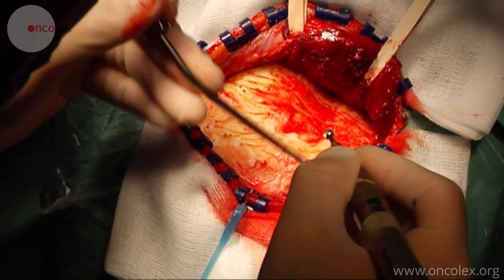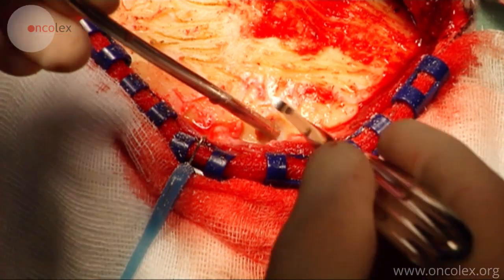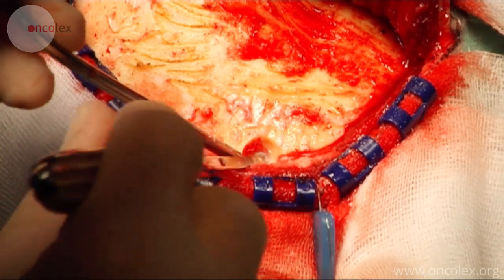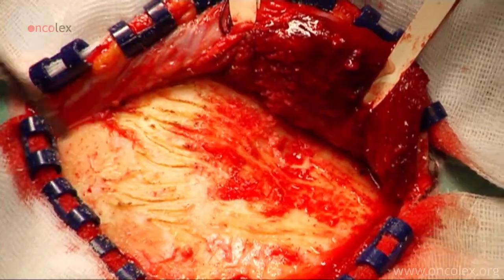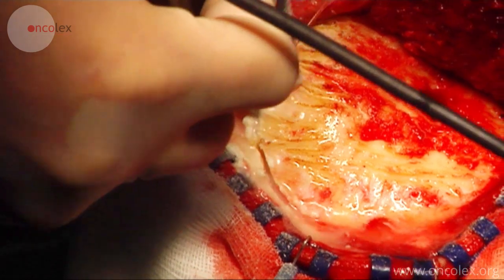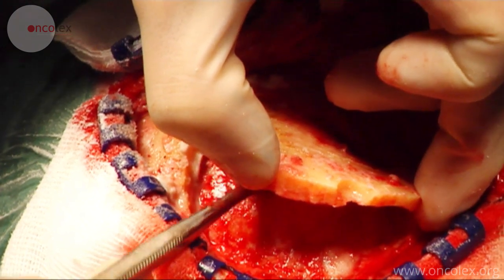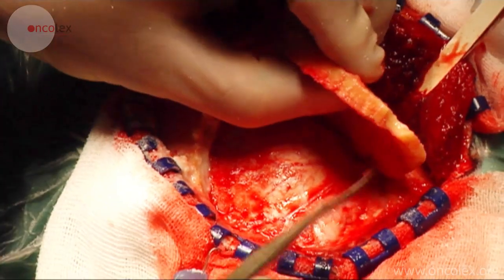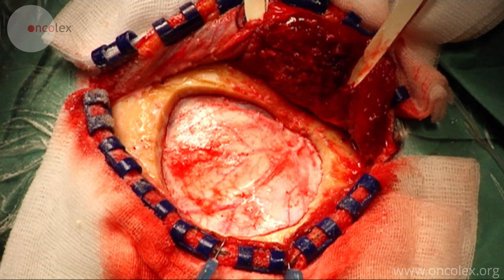The craniotomy starts by drilling two holes in the cranium. A bone flap is then cut out starting from these two holes. The bone flap is carefully loosened from the dura mater. Here we are looking down at the dura.